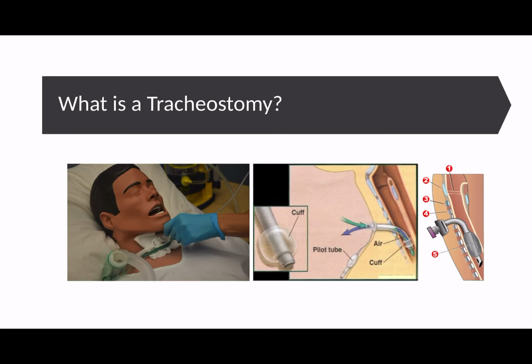There are different types, as I alluded to, and we'll go through those, but the most common type, and the type that is put in first when a patient gets a tracheostomy, is a cuffed tube. So the cuff is very similar to that of the endotracheal tube, and we go through a lot of the details of this in my previous video looking at the endotracheal tube.